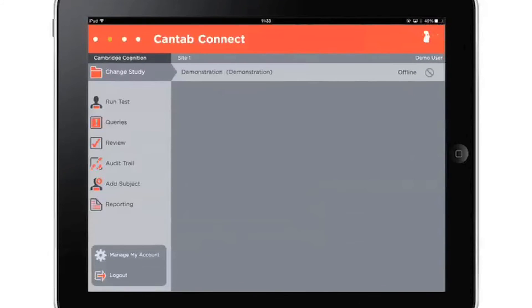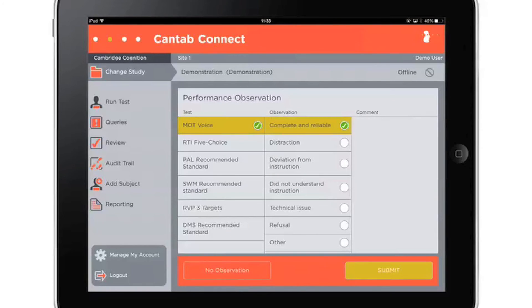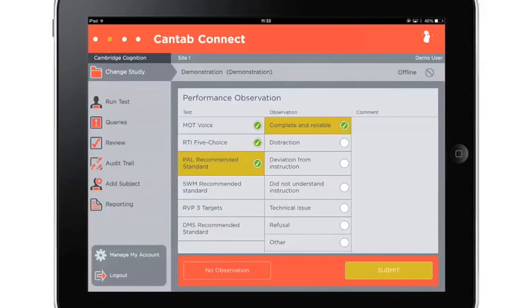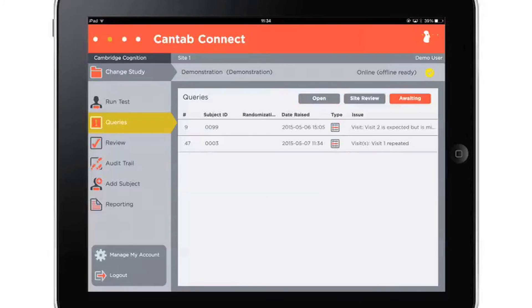The password protection prevents subjects or unauthorized users from accessing the data. Study results are automatically scored, stored, and ready for analysis immediately after collection. After testing a subject, raters are prompted to fill out performance observations for the testing session they have just conducted. The data and performance observations are monitored, cleaned, and any queries resolved by our data management team.